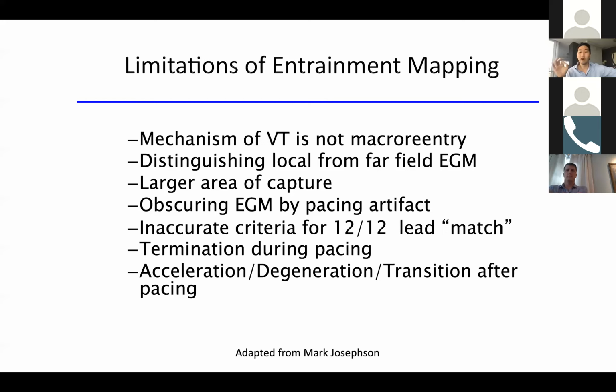Distinguishing local from far is the hardest thing to do, which is why we planted Phil there in the audience to ask the question, how do you tell with multi-electrode catheters? We're gonna get even harder right now. A large area of capture is a problem.